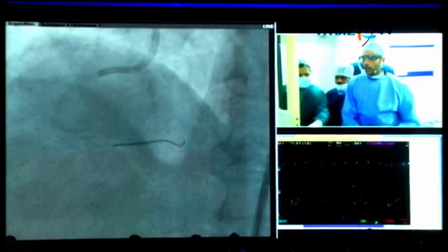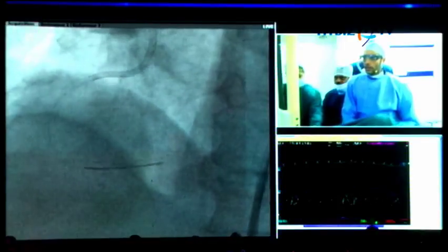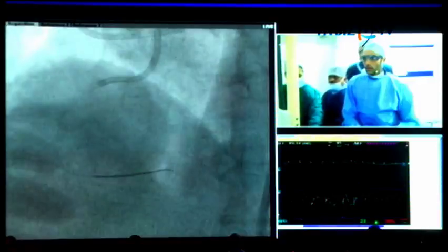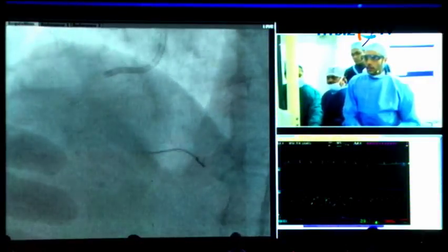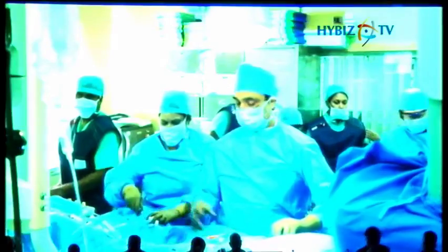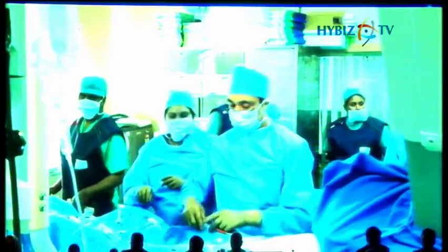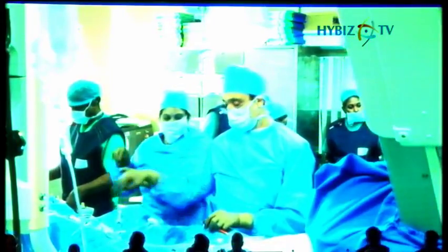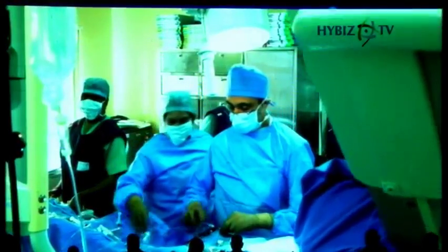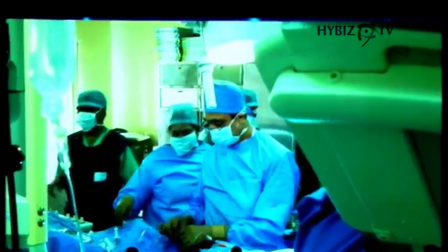Yes, the idea is that in 2 to 3 months there is a sealing of the distal part of the dissection, and you have the entry of the true lumen, so you stent only the proximal part. This is the study that has been performed. You prevent going retrograde to stent all the way through, because now it is clear it will be a long dissection and a long stent. Arun, this is the idea. And when the flow is good, this is also very successful.